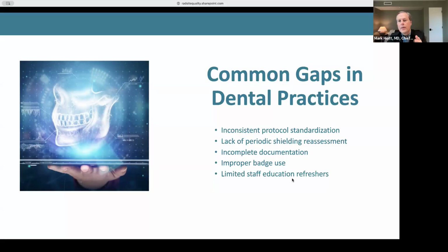Wonderful. Chris, what do you think about what Vino says in terms of having safety and quality permeate the culture? Does it need to come from the top, from leadership? I believe it always comes from the top. Consistent badge wear, walking around, seeing someone not wearing a dosimeter is very important, because people forget, or they say, oh, I left it in my car, and I don't want to go out to my car and get it. So there are a lot of ways that leadership can help in this aspect.